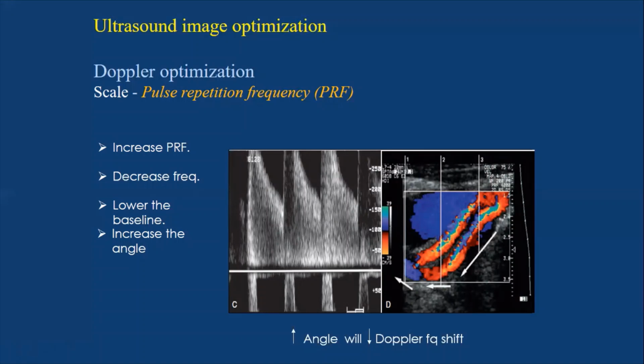As we go from 0 angle to 90 degrees, the cosine will disproportionately affect the Doppler shift. What I mean is the value of cosine theta will be reduced, approaching 0. At the same time, this will also reduce the Doppler shift. Everything is about the equation. This is why increasing the angle will reduce the aliasing.